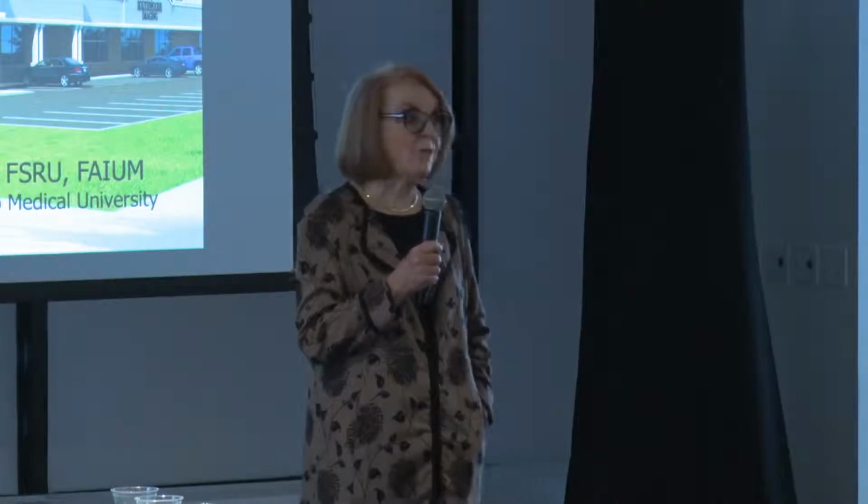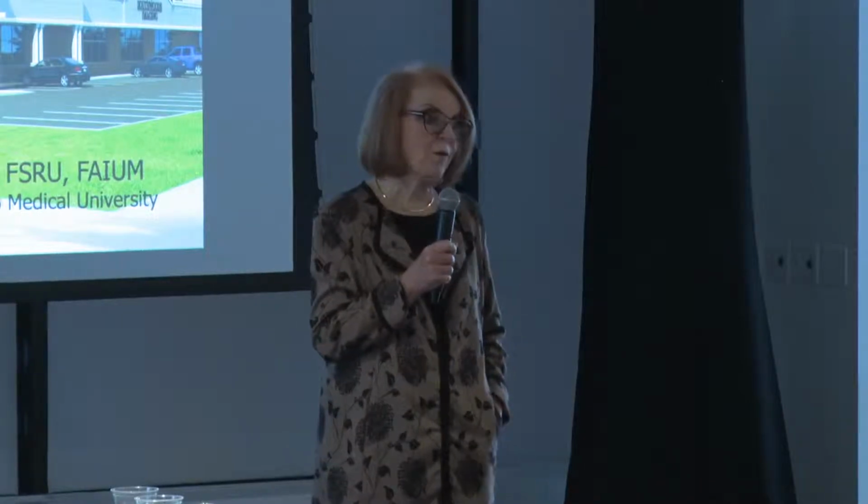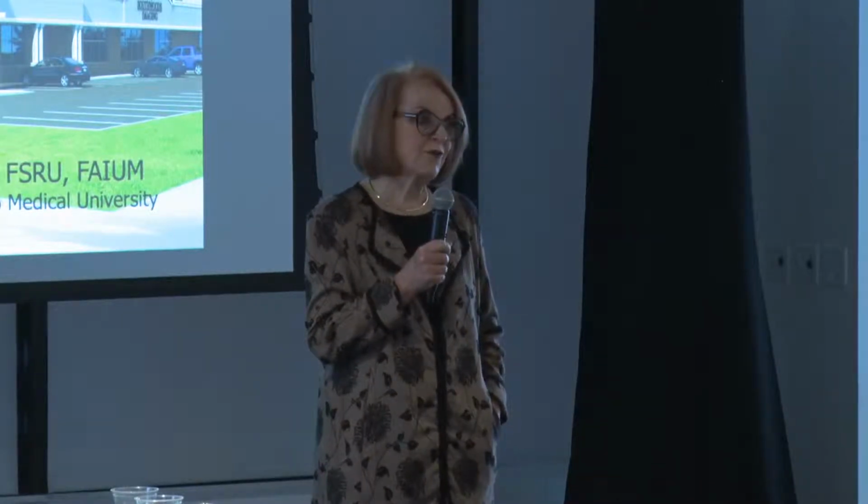Now, FNH you have to be more careful about, because over all my years that I've been doing this, I now have about 3 histologically proven HCCs that have stellate vessels. So nothing is a slam dunk. It's great, but it's not a slam dunk.